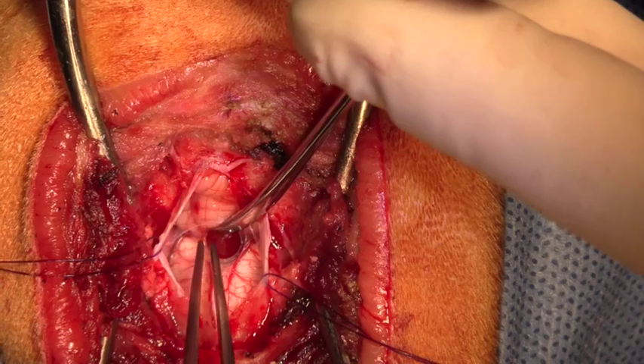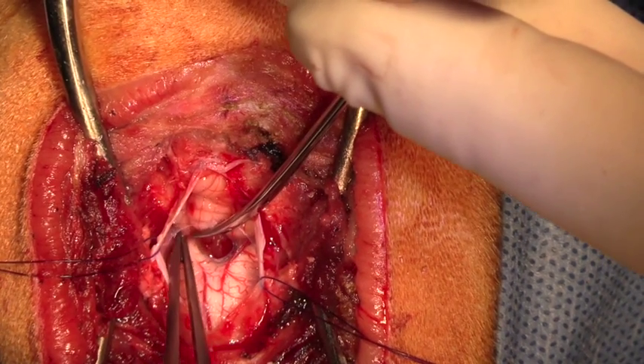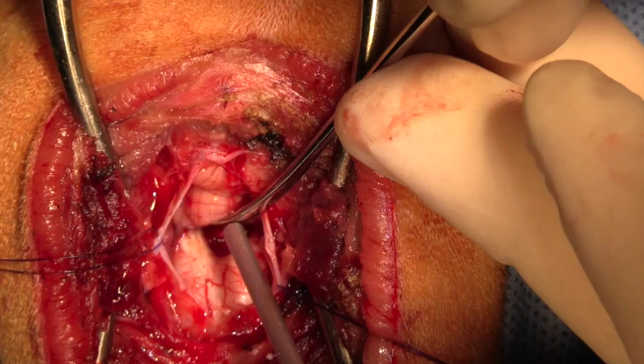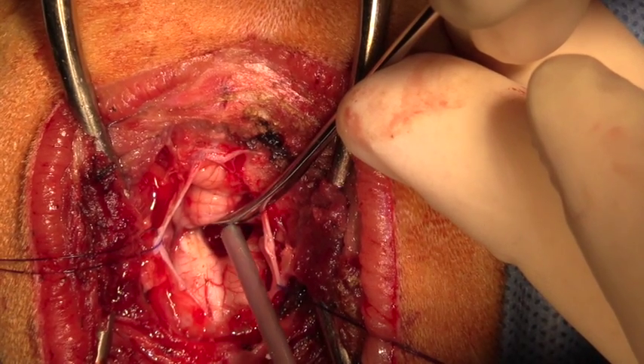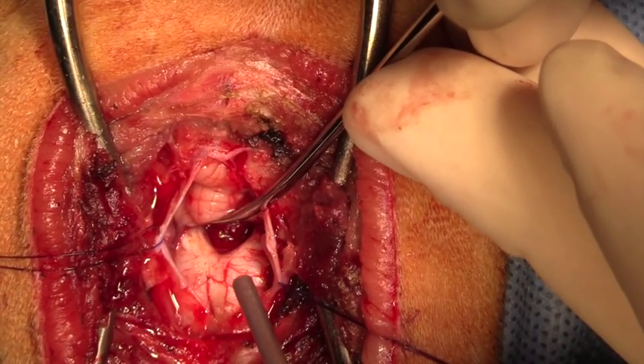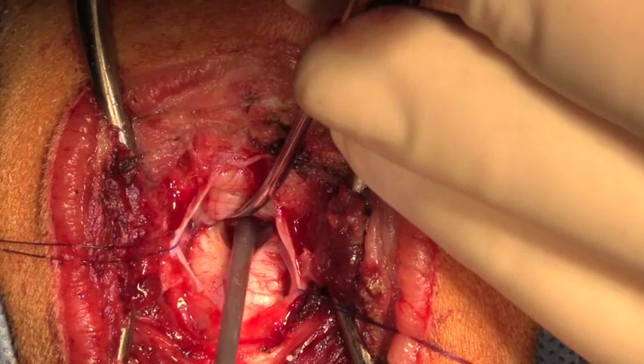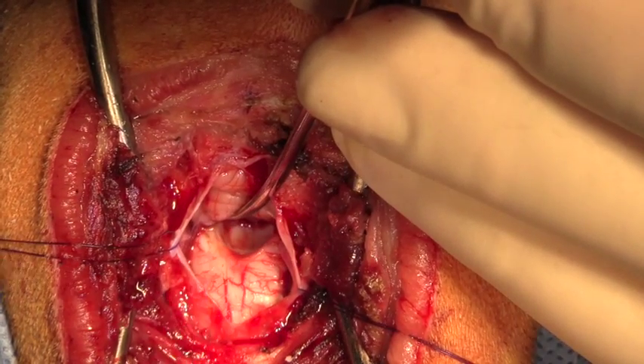Now as we look in that space we can actually see the mass, which is probably a choroid plexus tumor on the floor of the fourth ventricle. We're carefully using suction to better visualize that mass, and then when we close the vent on the suction we're actually able to remove that mass in its entirety.